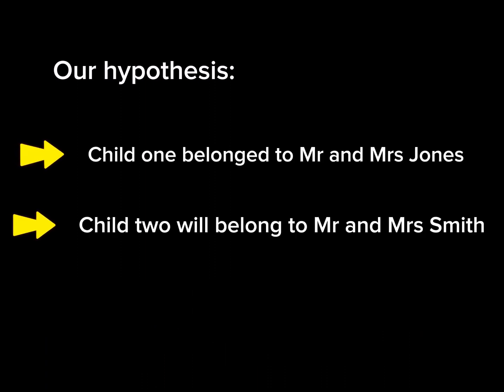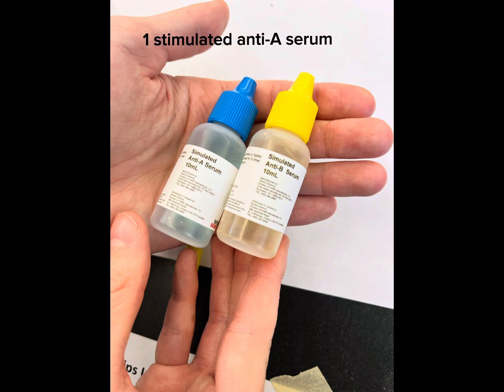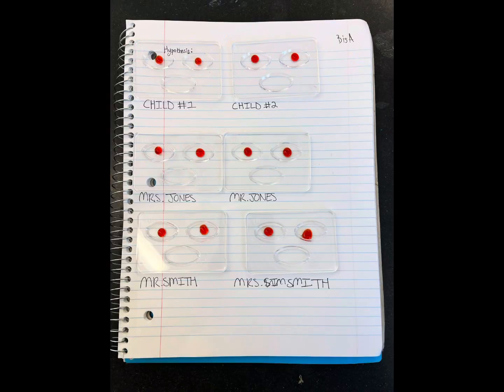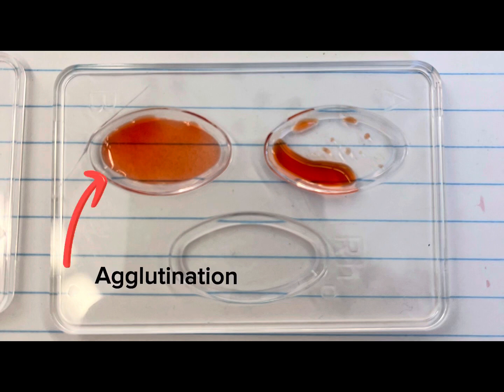As for the test itself, our materials included 12 toothpicks, 6 simulated blood samples, 1 simulated anti-A serum, and 1 simulated anti-B serum, as well as 6 blood typing trays. Now, blood type is determined by the presence or absence of certain agglutinogens that are located on the surface of erythrocytes. If there is a presence, a cloudy and foggy mixture will appear. This is called agglutination.